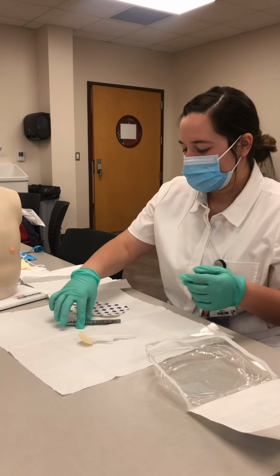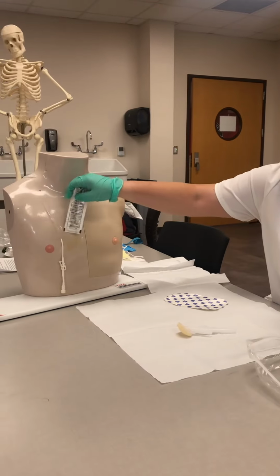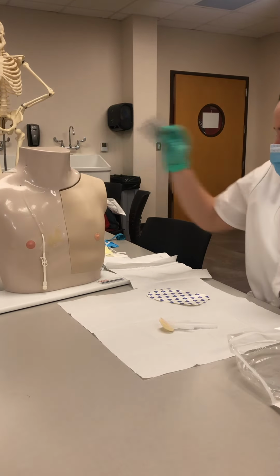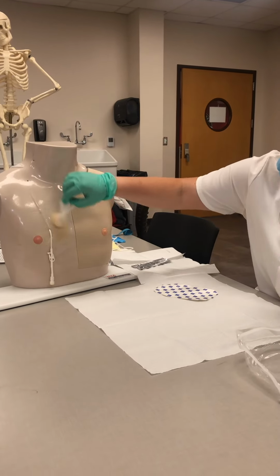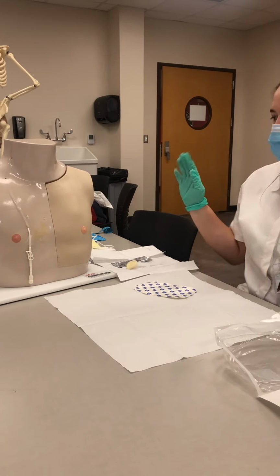So we're going to take our alcohol swab, and we're going to clean. We're going to go vertical, horizontal, zigzag, just cleaning all around the catheter insertion site. We're going to throw those away, and we're going to take our sponge, and we're going to scrub that in circular motions. And then throw that away, and we're going to let that air dry.